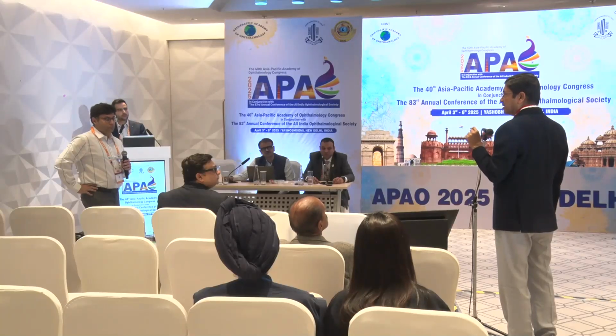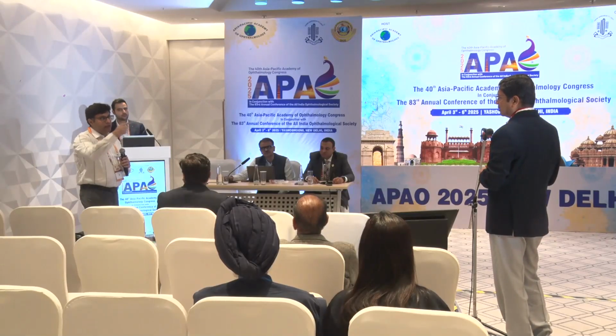So if you at all have to put a sulcus lens in the sulcus, it has to be hydrophilic. So it's not about the material per se. No, when I said it's about the thickness of the haptic. Thickness of the haptic is more in hydrophobic lenses than hydrophilic. So the present day hydrophilic lenses that we use, they have that hole in the haptic and they have a double haptic around, like the typical Rayner and the Ultima design that we are talking about. Less thickness. Okay. So my experience has been reverse, but point well taken. And so always put a suture.